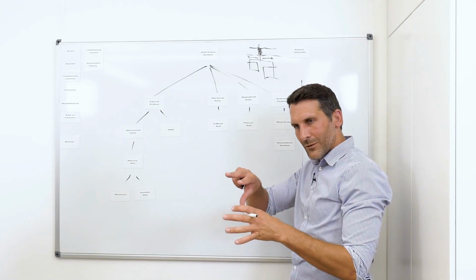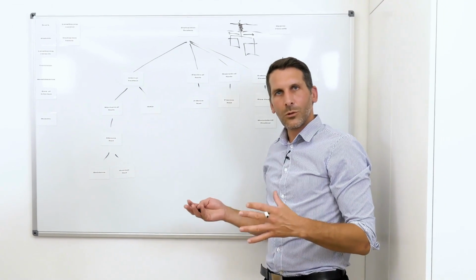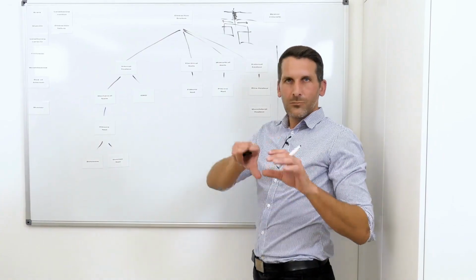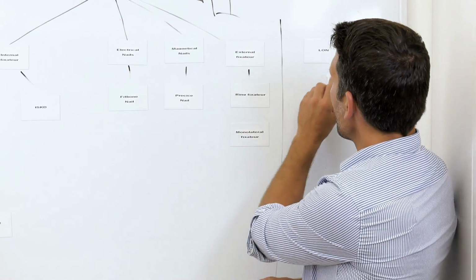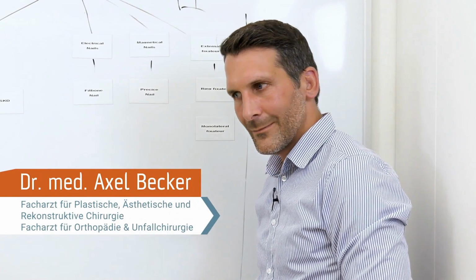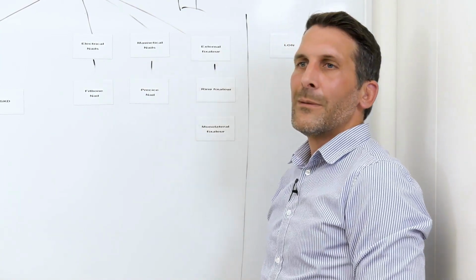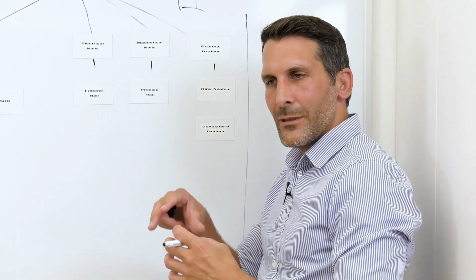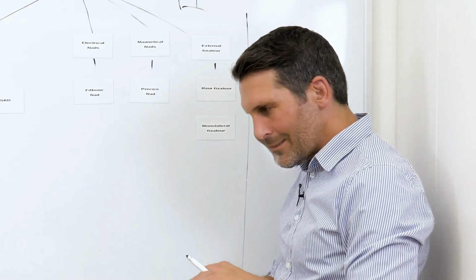In the worst case, the whole system bends like this, so that they either develop a crazy bow leg in the lower leg area, or even in the thigh area, the bending can't be held at all. And for that reason, this LON originates. This basically means that you cannot use just an external fixator. That means you have this monolateral system and add an internal nail to increase stability. To ensure stability during distraction, that's basically it.